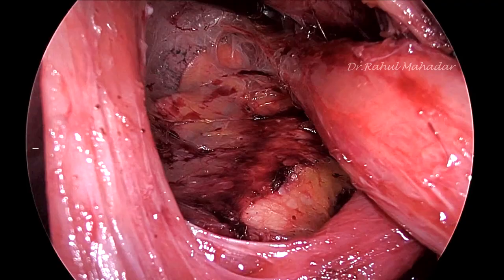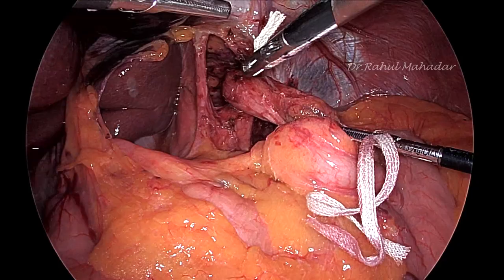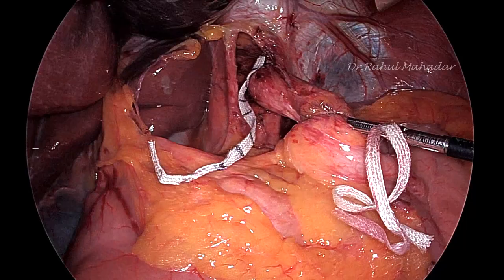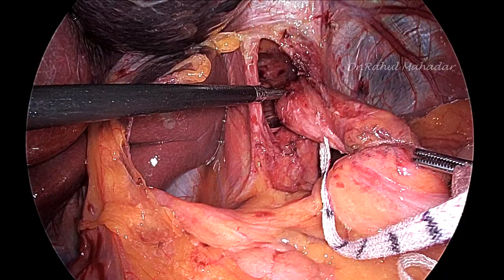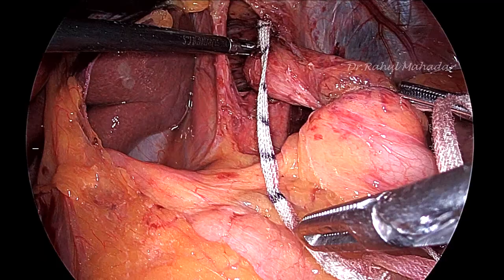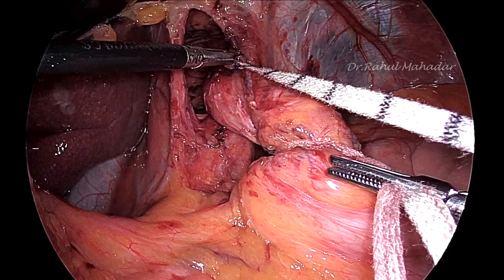See, we have mobilized quite enough now. So now we will measure how much lower esophagus is mobilized. With traction it should be approximately 6 to 7 centimeters. So this is the umbilical tape with marking of 1 centimeter each on it, and we measure it, so it is almost 6 centimeters we have mobilized with traction. So you can very well see here 1, 2, 3, 4, 5, 6, 6 centimeters we have mobilized.